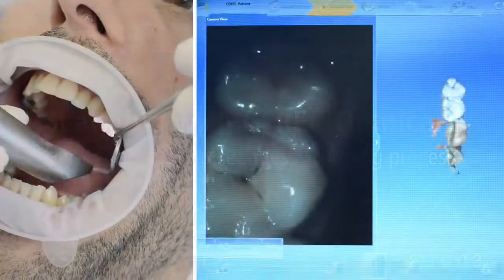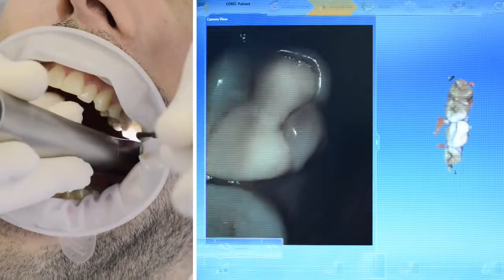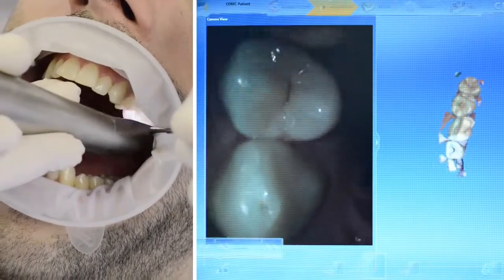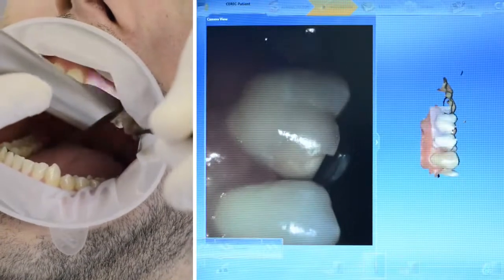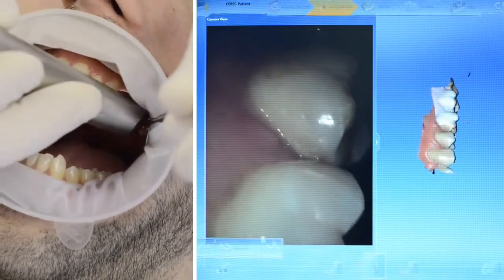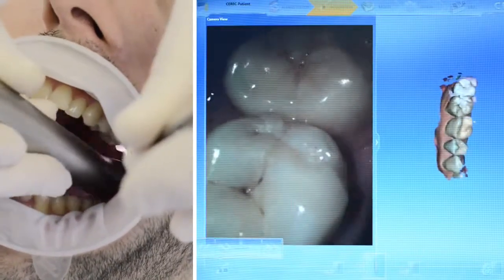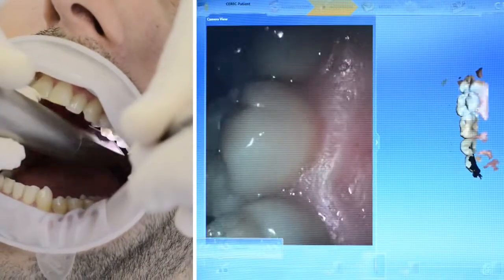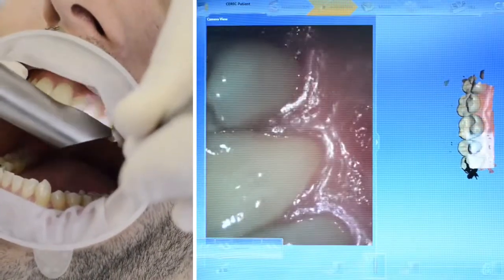With Omnicam, both jaws can be optionally scanned before preparation. The prepped teeth can be added to the virtual model later. The Omnicam has a small head which allows easy access to the posterior teeth. The user simply moves the camera head closely over the teeth in a single flowing movement.